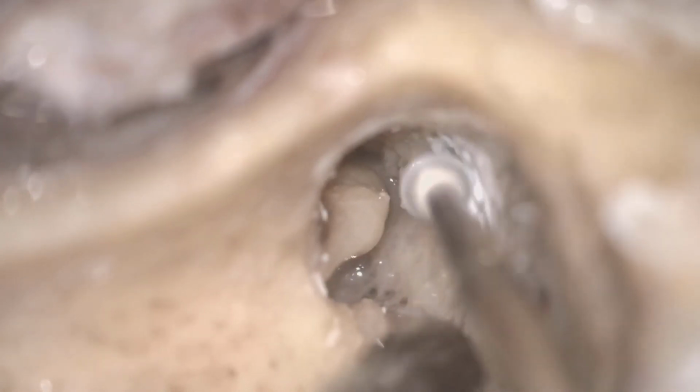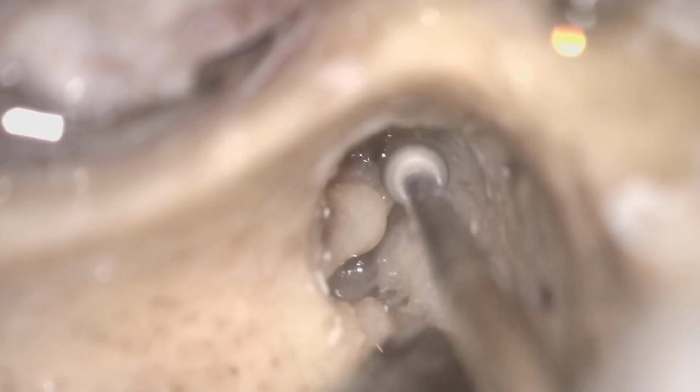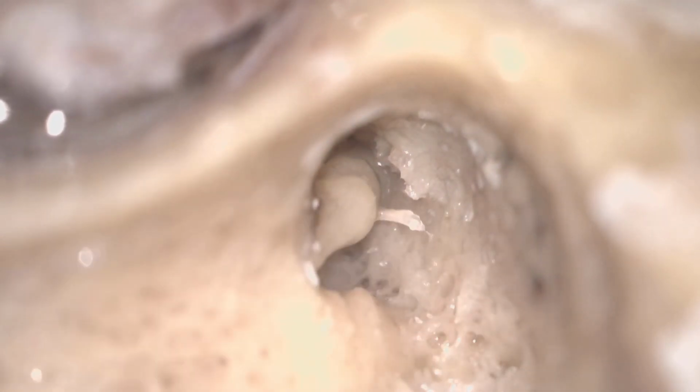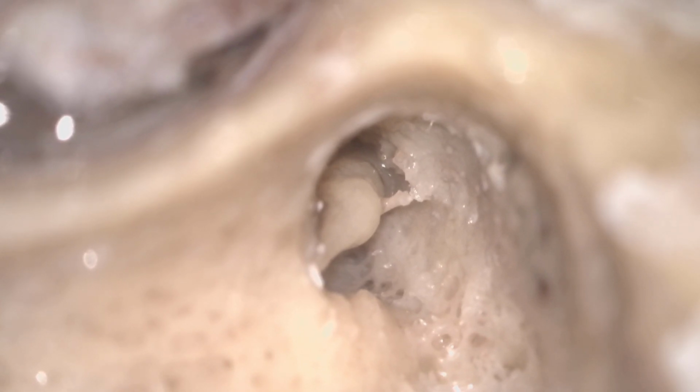Yes. Significance: it is the demarcation between the anterior and posterior epitympanum. Yes. As well as it defines the first genu or geniculate ganglion of the facial nerve. So this is also an importance of the cog when you are doing facial nerve decompression.